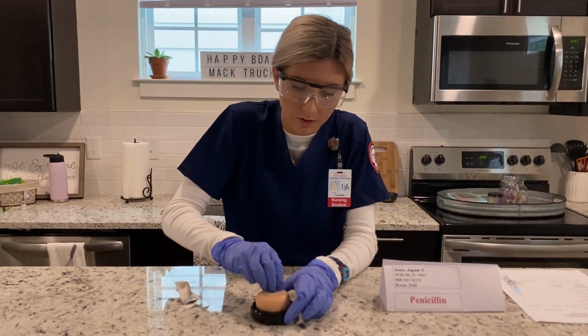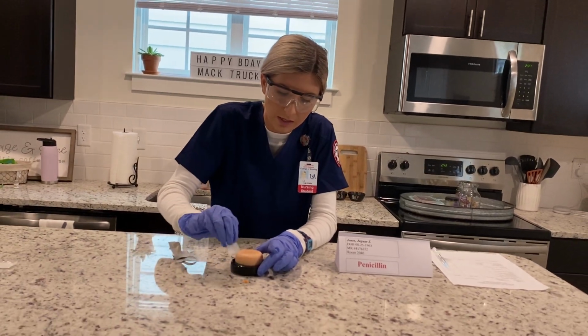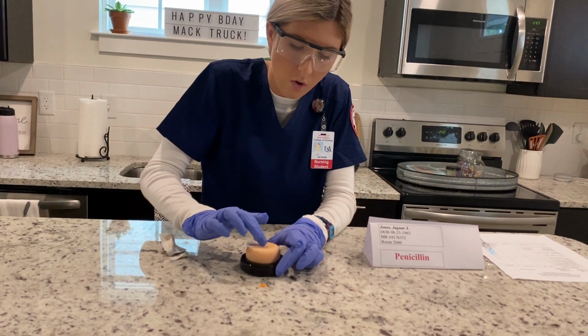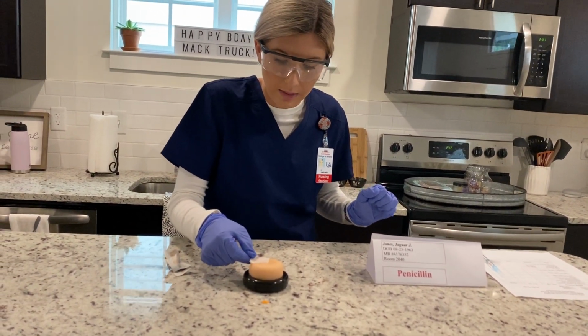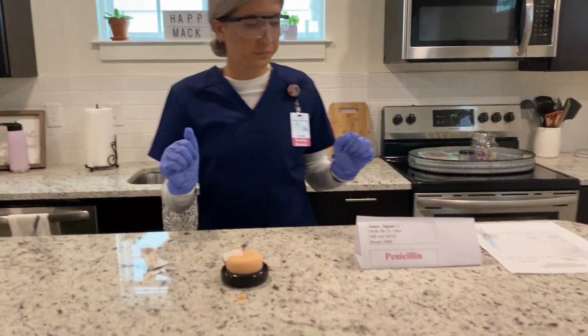I'm going to do this in a circular motion, and then I'm going to leave the alcohol rub pointing at the clean area and let it dry.